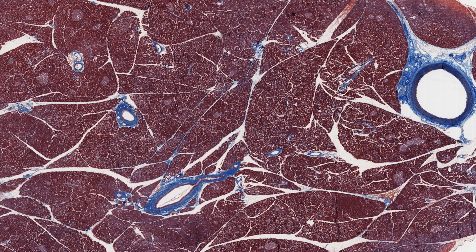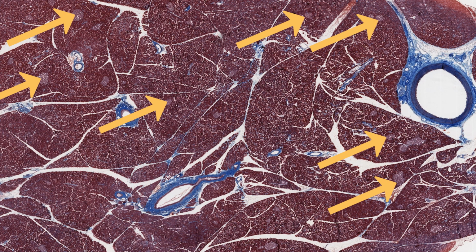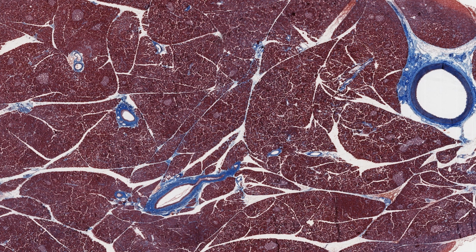The endocrine portion is a series of pancreatic islets, or islets of Langerhans, that you can see as small, rounded, paler areas embedded within the lobules of exocrine glandular tissue. These pancreatic islets produce insulin, among other things. Their destruction leads to diabetes, as you undoubtedly know. I'll describe these pancreatic islets in my lecture series on the endocrine system.